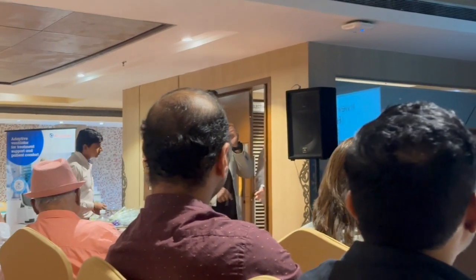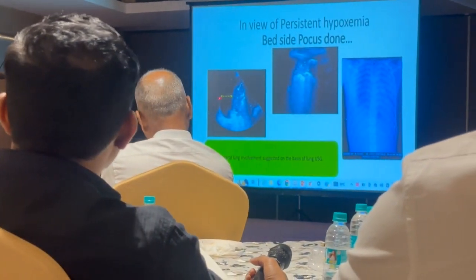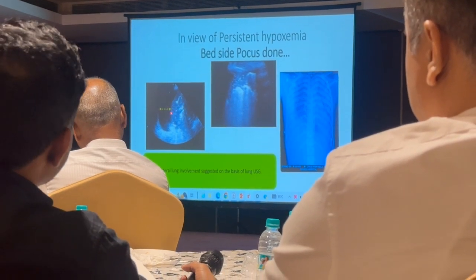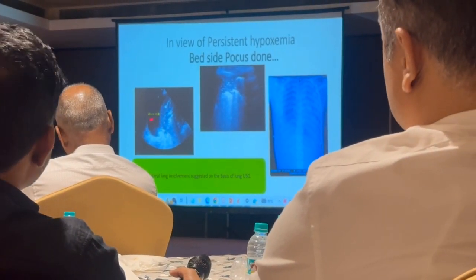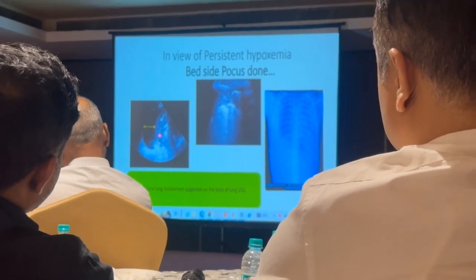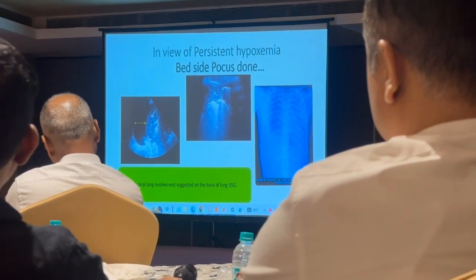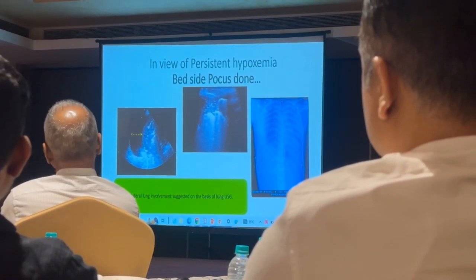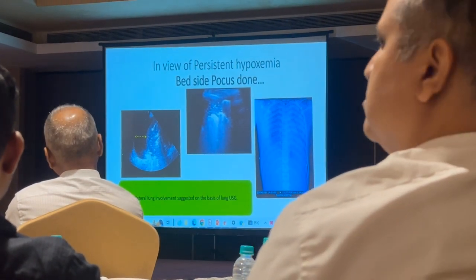So when Ankit did the lung ultrasound, as Dr. Sharma said, the right side of the lung was having a significant effusion. It was a transudate because there are no fibrin deposits which can be seen. Plus, there is collapse and consolidation. You can see static dynamic air bronchograms, static mainly, right? Even in the left lung, you can see fractal sign. So which you were talking about, Dr. Sharma, on the X-ray, my impression was different, but when he did the lung ultrasound, it changed to your opinion that yes, we are dealing with ARDS.